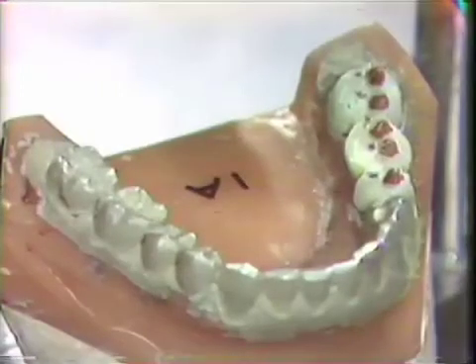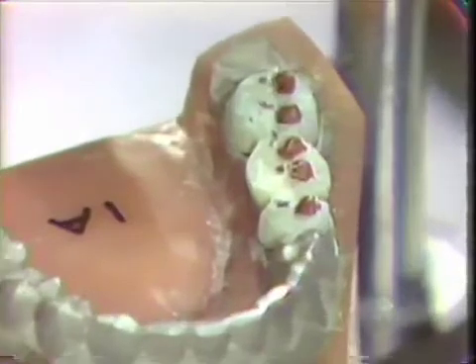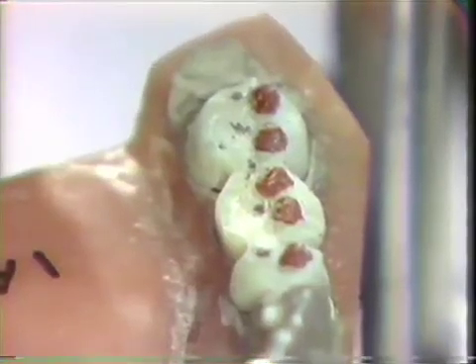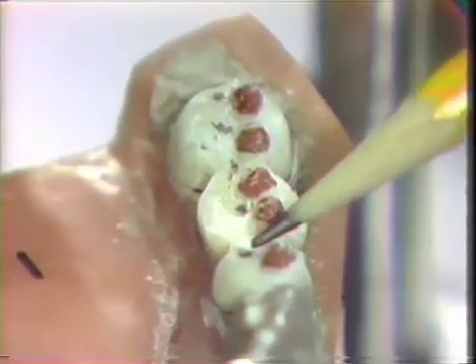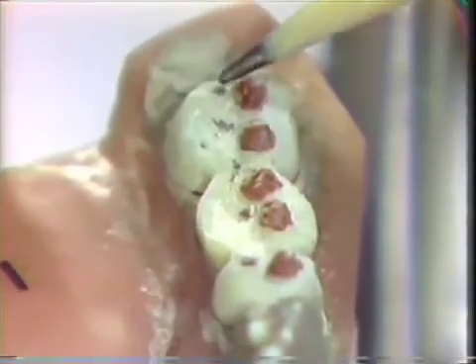We've now completed step 1 by adding the red wax, dusting with zinc stearate, closing the articulator to ensure that we have contact in the black opposing cusp fossa areas on the maxillary cast. Our second step will be to develop on the mandibular teeth centric stop areas for the maxillary supporting cusps. And to do that, we've outlined with black pencil the potential areas where these cusps will articulate.